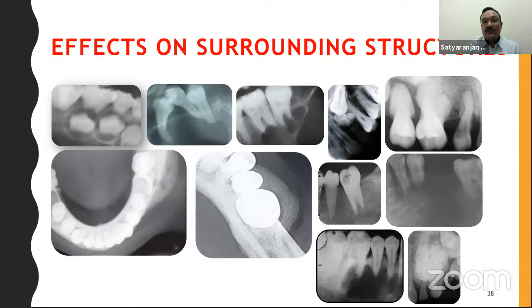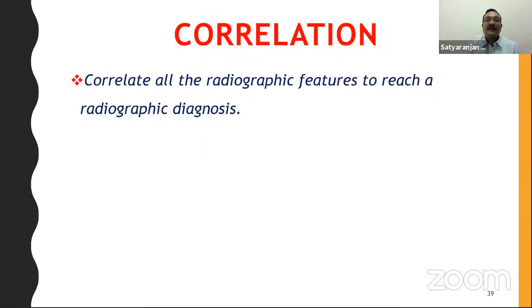We as dentists need to check out not only the teeth, but also the adjoining structures. The jaw bones are also our area, similarly for the temporomandibular joint. Now, one thing that we often do is for a temporomandibular joint disorder patient who comes to a clinic, we advise a panoramic radiograph. Now, the panoramic radiograph actually does not show us the condyles well, although it shows us bilaterally. The condyles are not typically oriented for diagnosis, so you need different views for that. So that needs to be kept in mind.